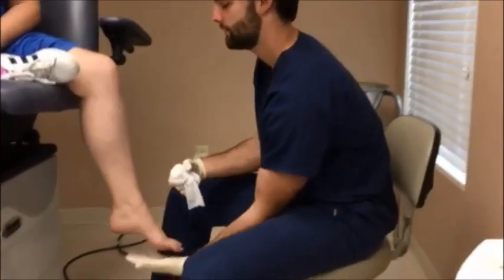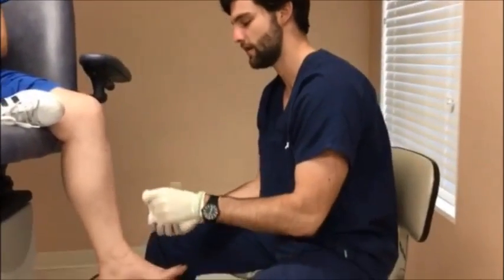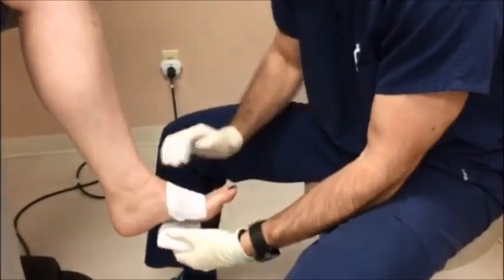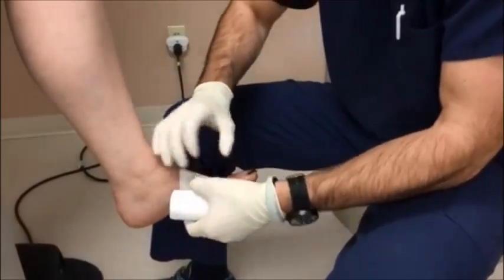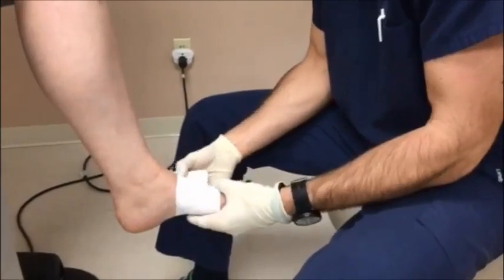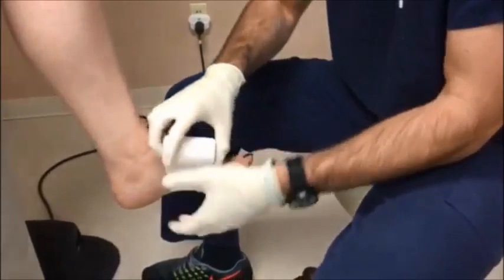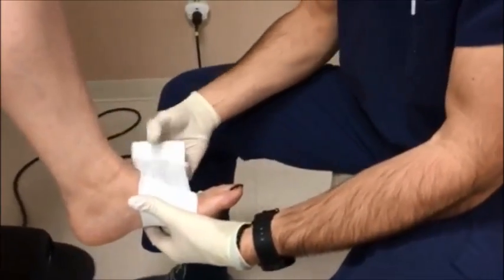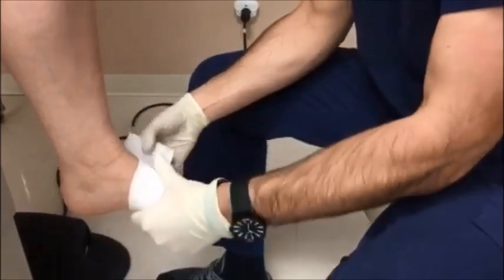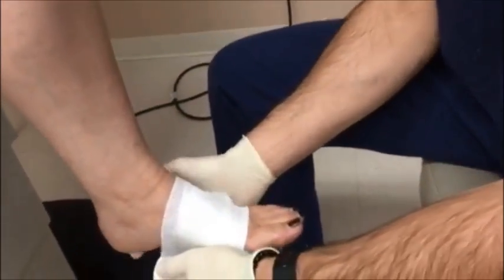So it applies much like a hard cast, but this is a soft cast. You start it over the first and fifth metatarsal head, just as you would a wrap of an ace bandage or another cast. You go over that about 2 or 3 times, and then you start to rock your foot just a little bit. So you go back and forth like so.